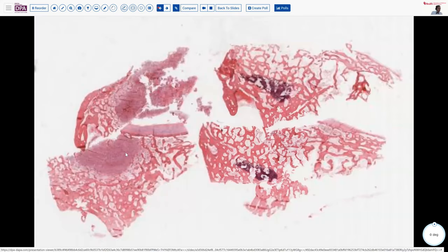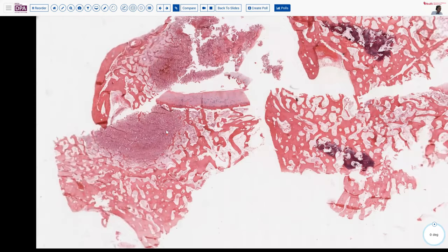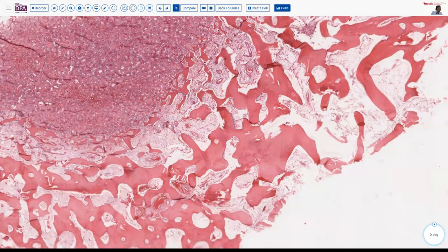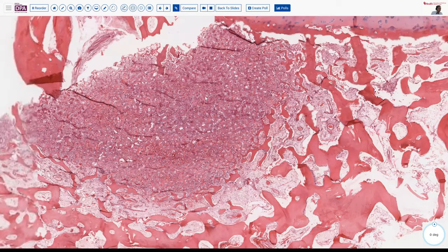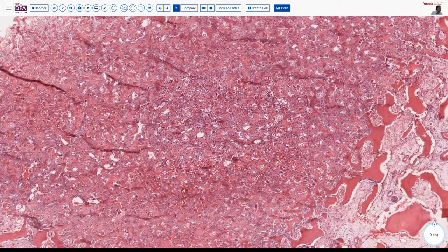So microscopically, here's the representative section. We can see that we have a peripheral zone of cortical type bone. Then we have this little zone of hypocellular area or less bone that corresponds to that lucency, with then an area of abundant bony matrix here in the center. And depending on the degree of calcification, this may still be lucent because this may not be fully calcified.